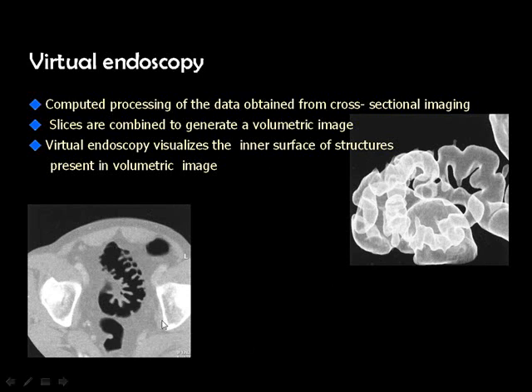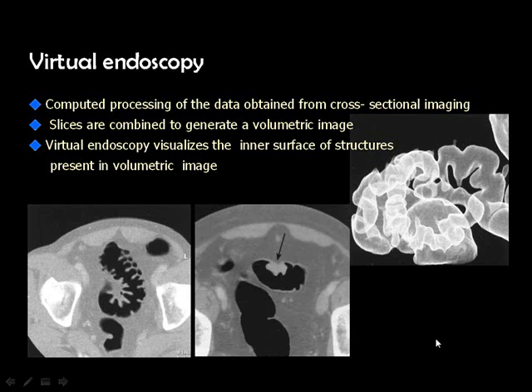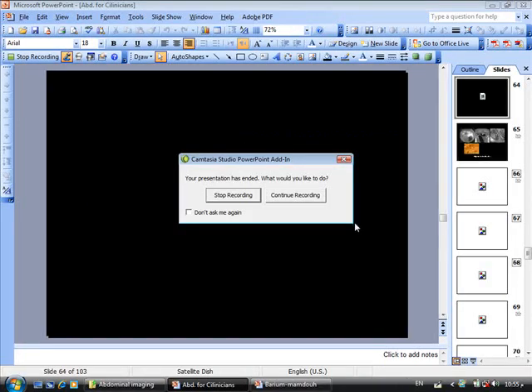Then you take sections in the abdomen to see the colon. Then you reconstruct this image for the colon, which is filled with air. Then you do this, and I hope this is working.